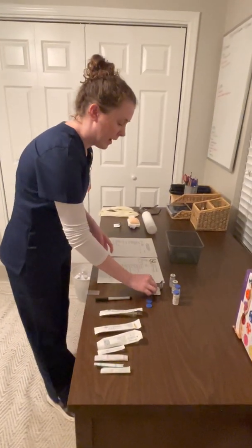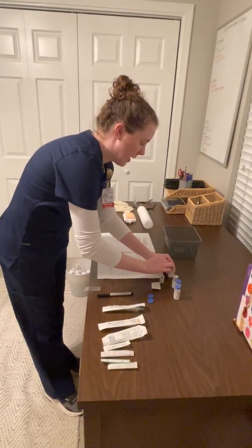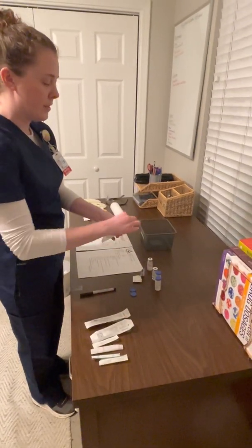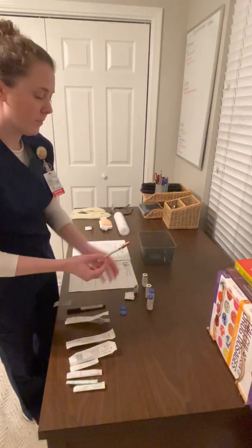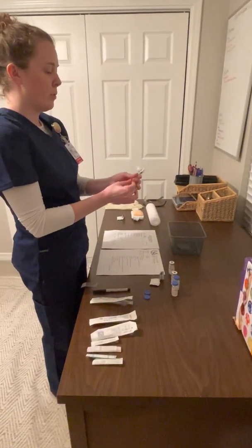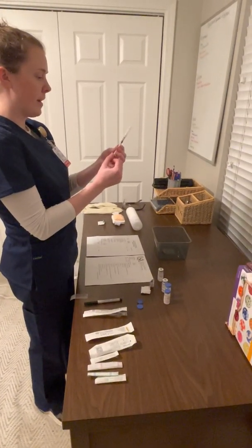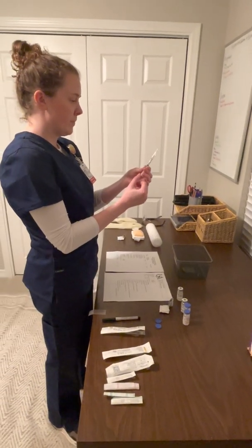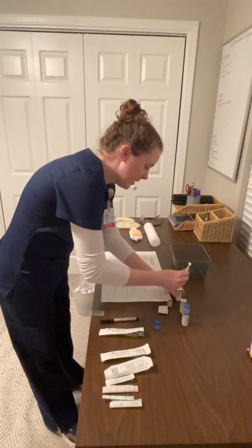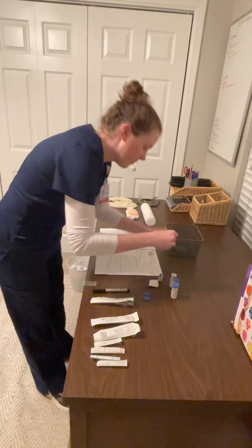So I will begin by cleaning off the vial of heparin with the alcohol prep pad in a circular motion. I would get my syringe. I would remove the cap and replace it in my sharps container. I would pull up on the safety and pull 0.5 milliliters of air into the syringe. Then I would pull back on my safety and administer the air into the vial.